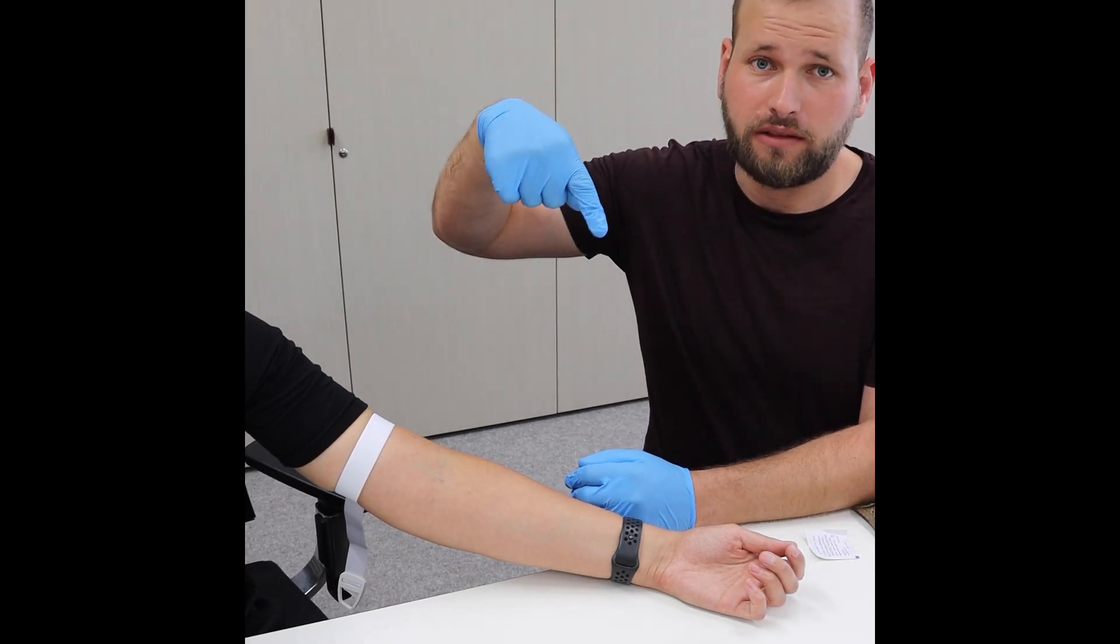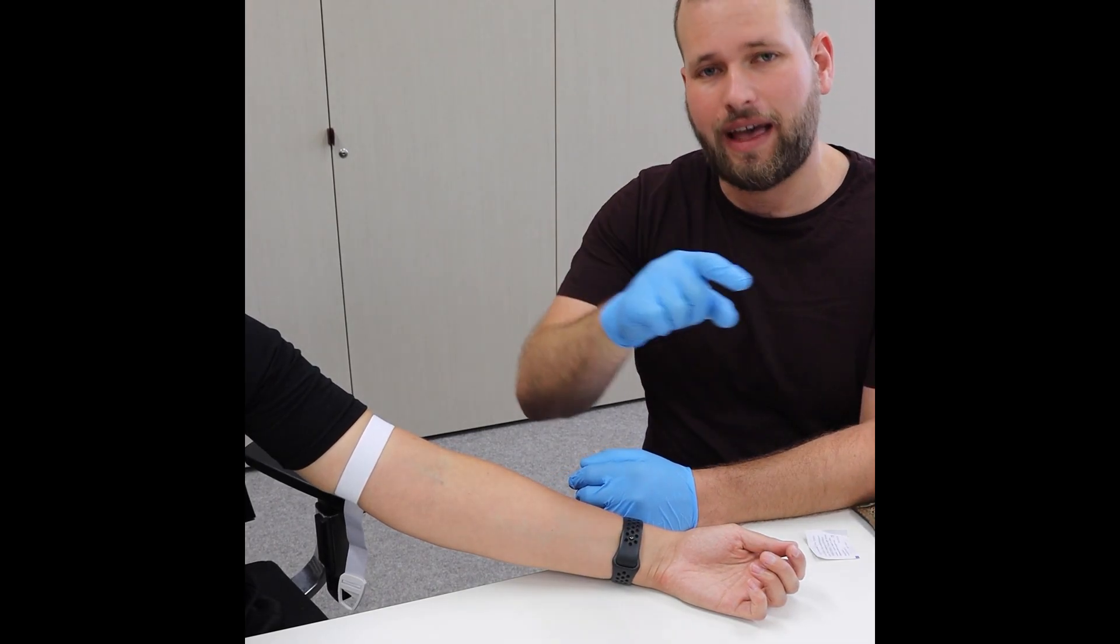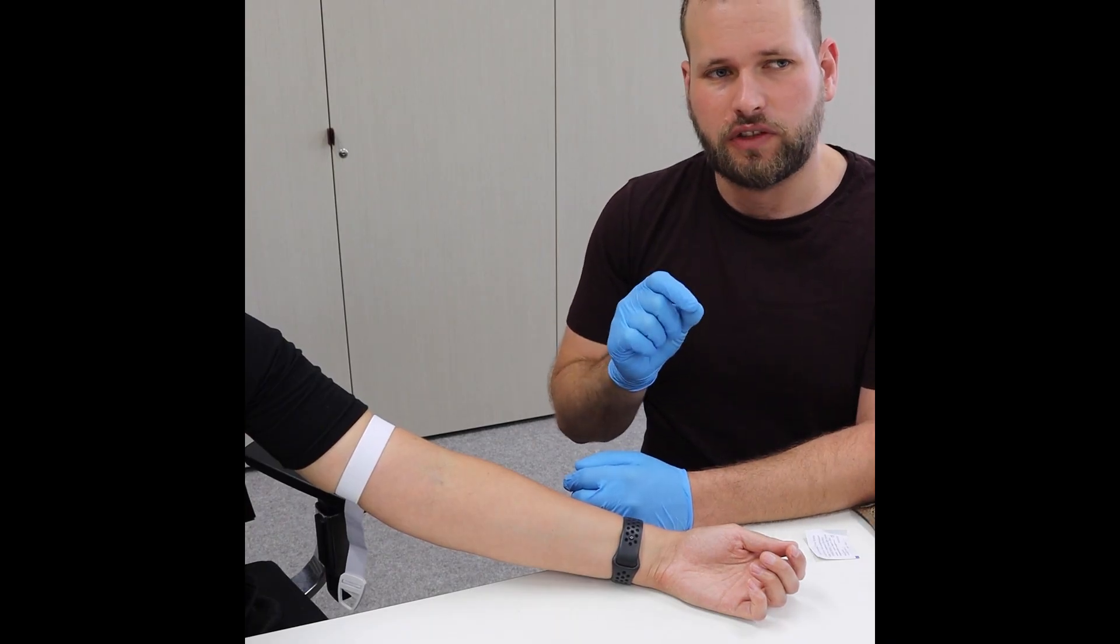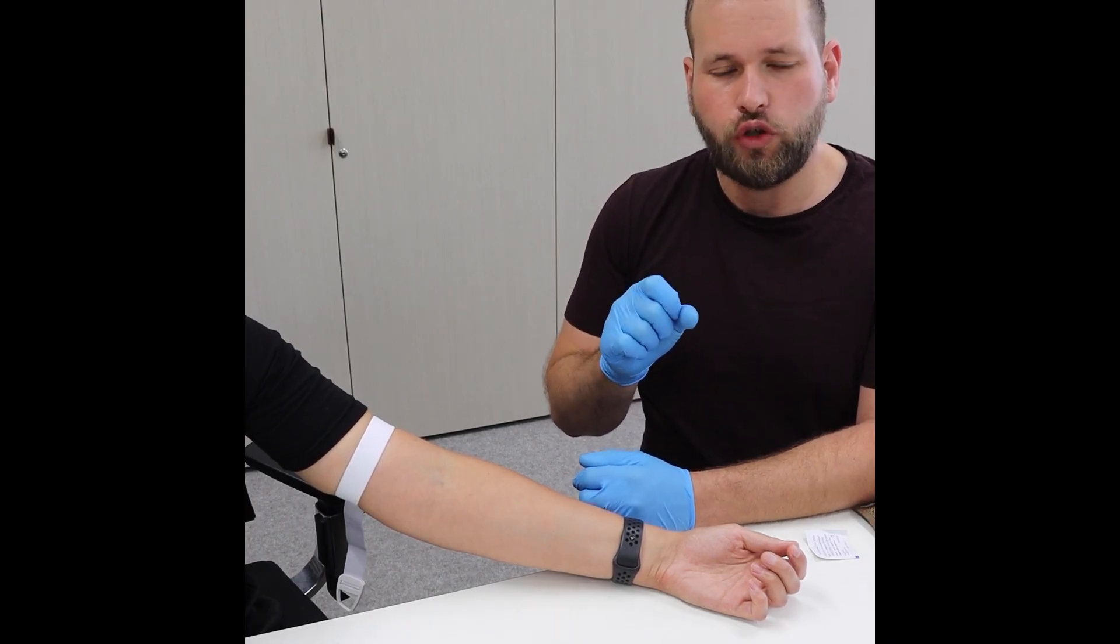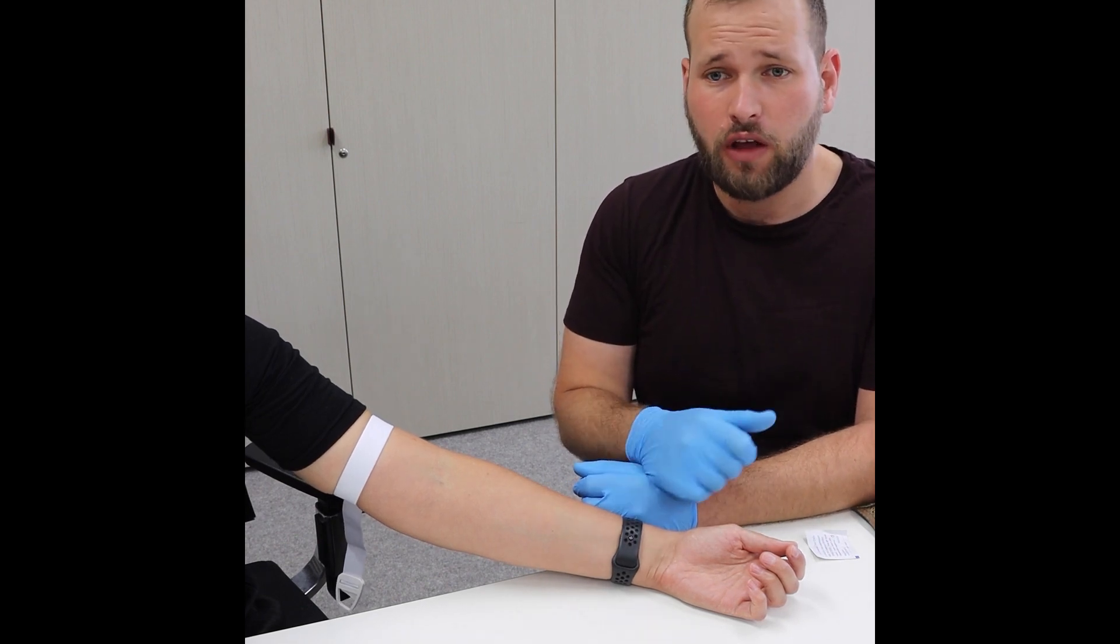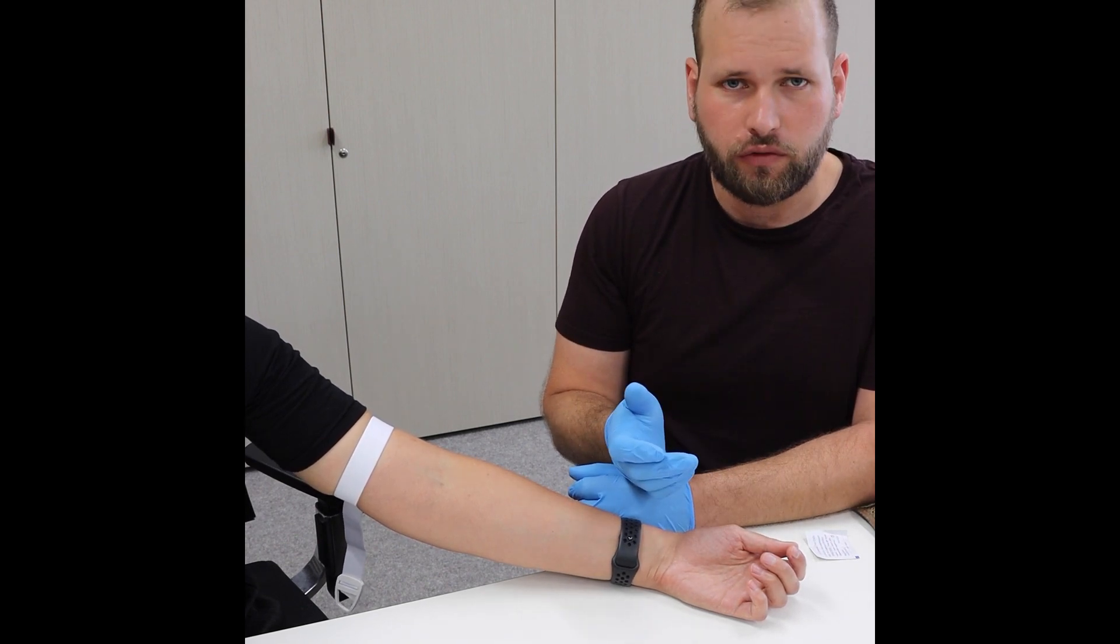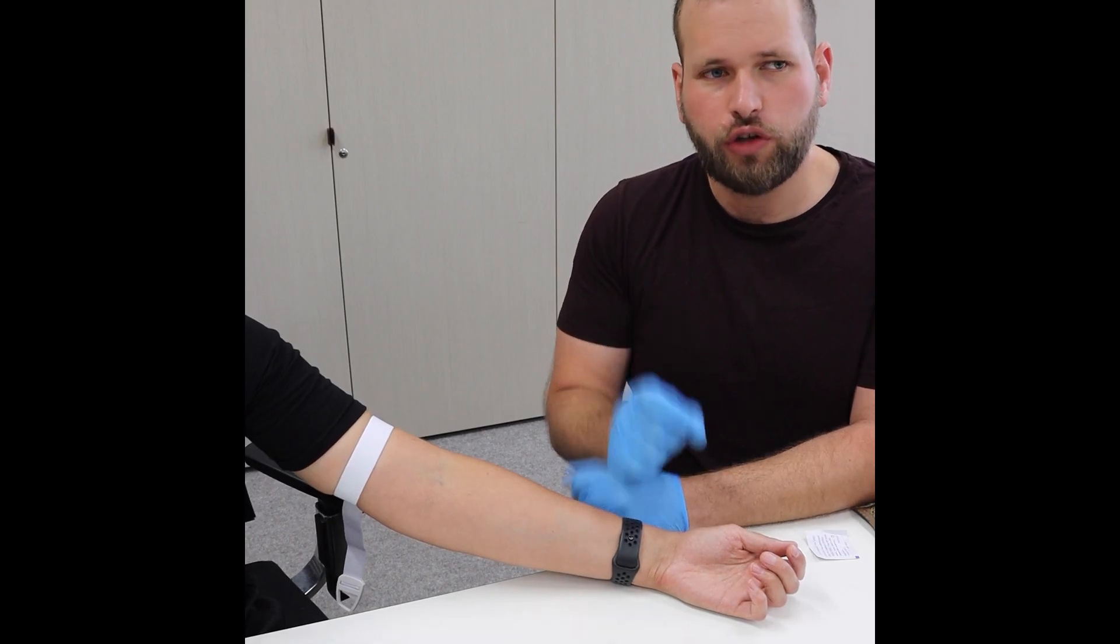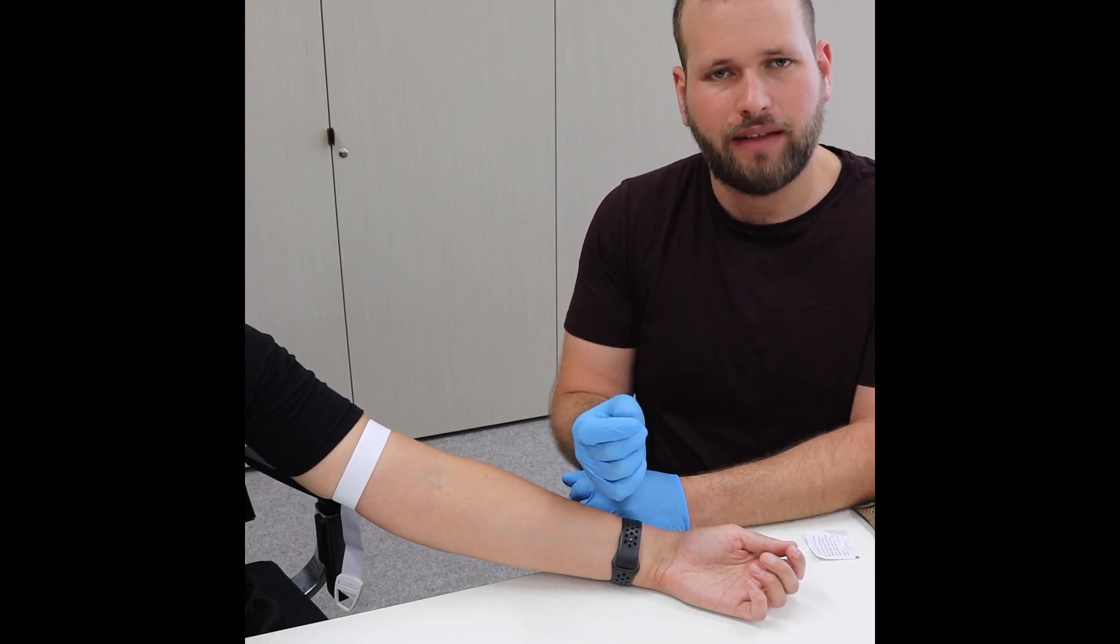You've come into the vein, you've got decent flashback, you've lowered down, you've advanced the catheter and you've felt some resistance. And what you don't want to do is push that cannula further because you're going to rupture a vessel, going to cause damage, you're probably going to lose the vein. But you're sure you're in the vein, so why can't you advance it?